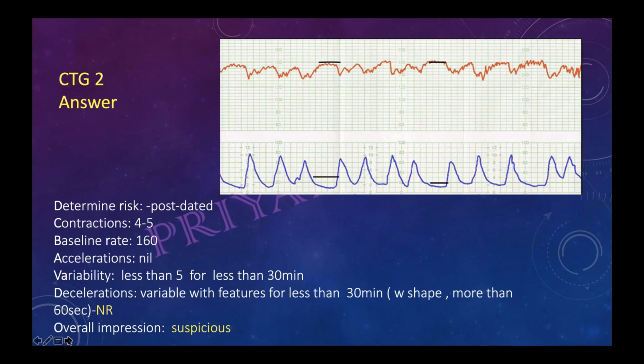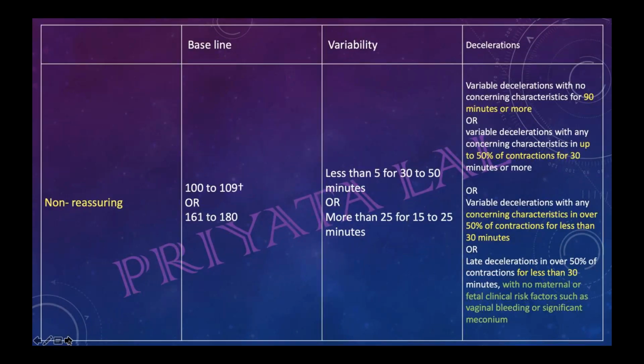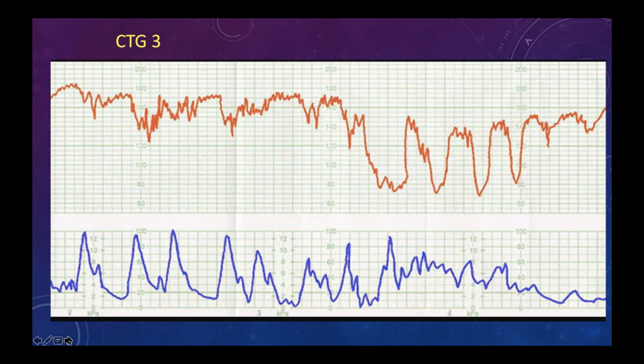So I think Ankita is next in the loop. Ankita? Yes, ma'am, I'll answer. I have got 35 traces, so everyone will get a chance. After that, I have got part 2 questions, so everyone will be able to do it. So don't worry. Okay, Ankita, do.